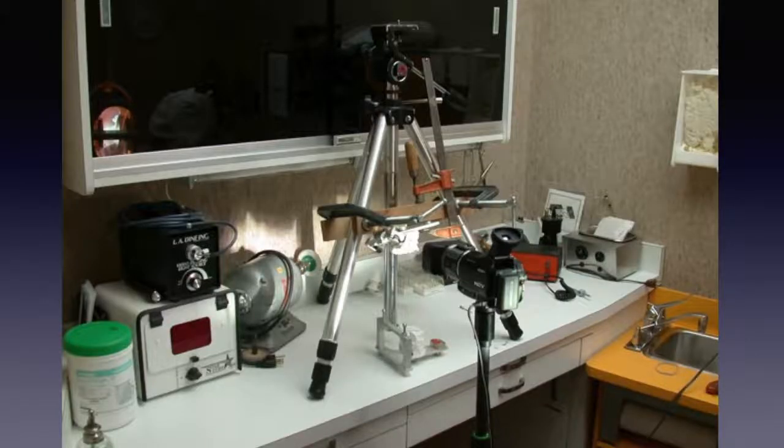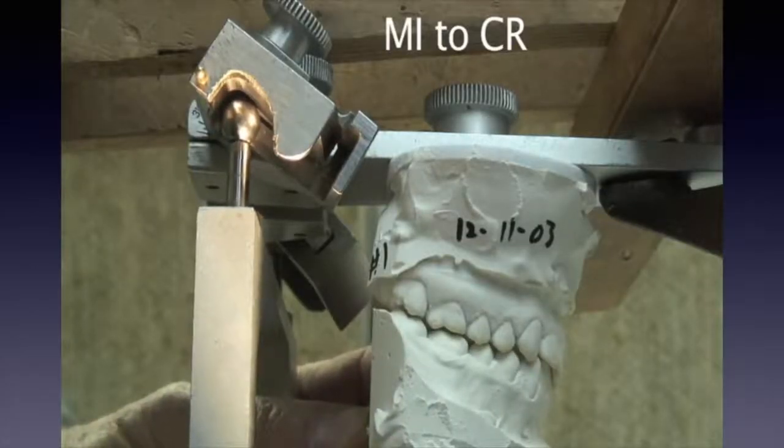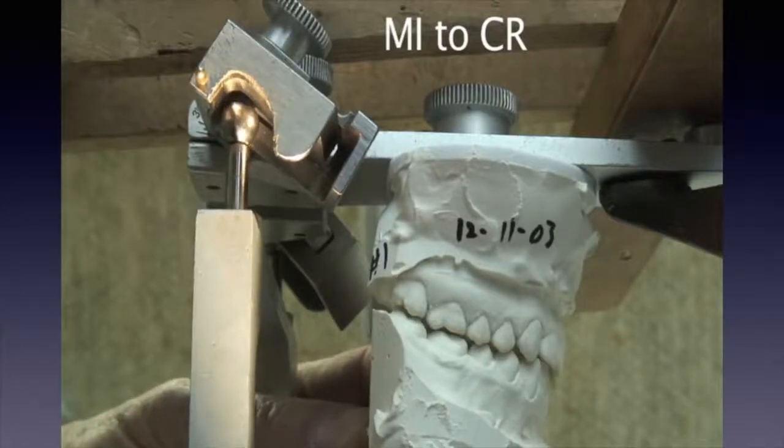This is our Rube Goldberg setup so that we could take movies of what the ball in the articulator does when the casts were moved from MI to CR. For 8 different patients chosen at random, simply the last 8 patients for whom one of our study club members had mounted casts. This is a mild condylar posture change from MI to CR.